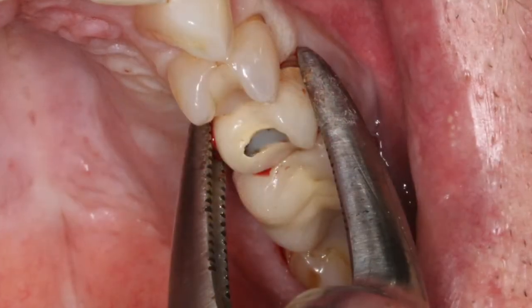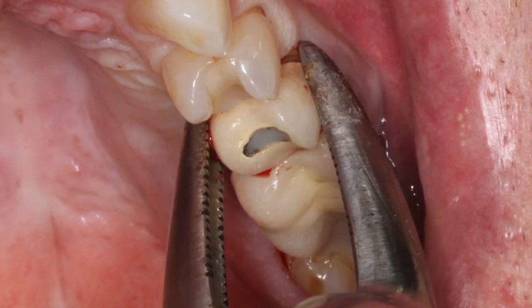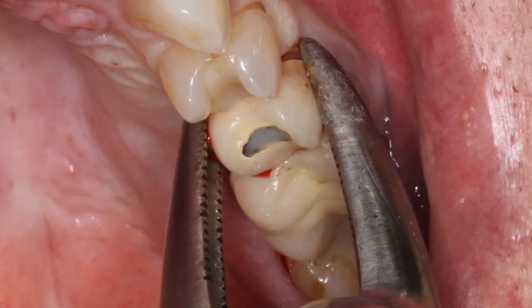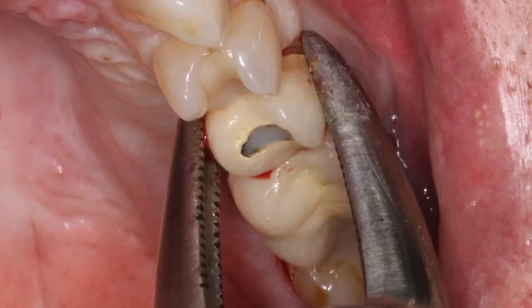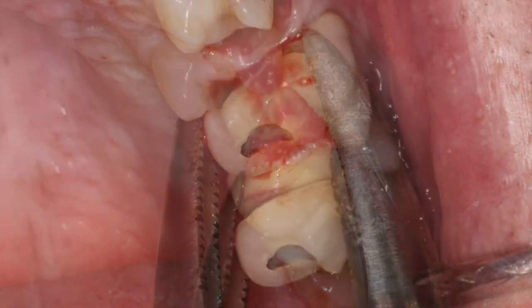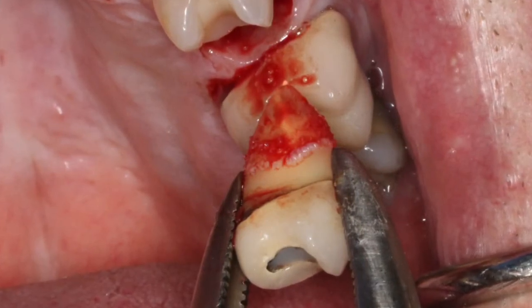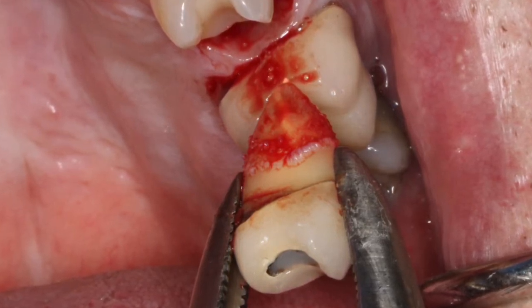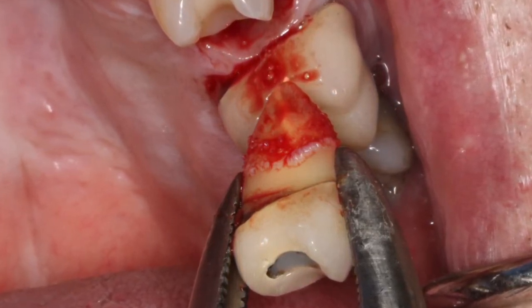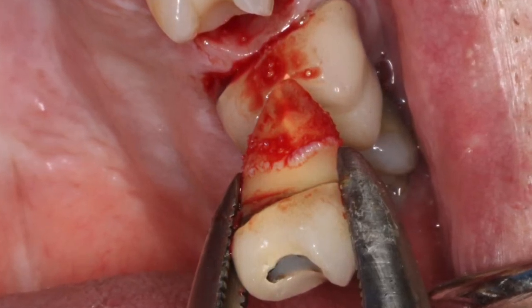The instrument is not intended to remove the tooth in total. Rather, it's intended to luxate the tooth 1-3 mm. We'll then simply take a tooth delivery instrument, a bird beak type of instrument, grab onto the tooth, and simply rotate that tooth up and out of the socket. The intent here is to maintain the facial plate of bone as possible, and also the interceptal bone.